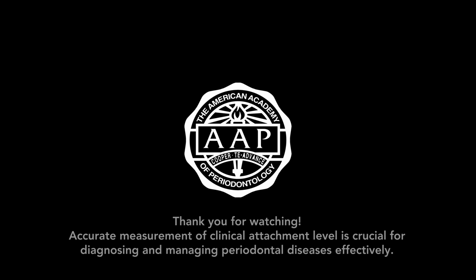Accurate measurement of clinical attachment level is crucial for diagnosing and managing periodontal diseases effectively.